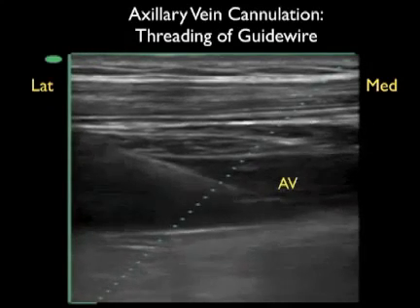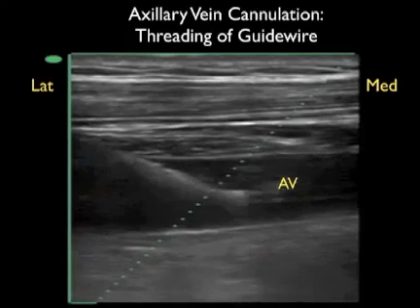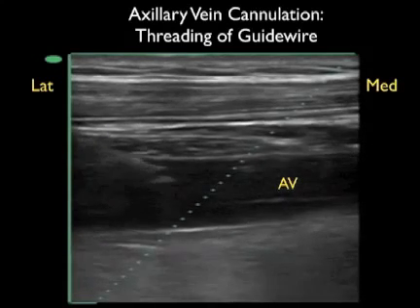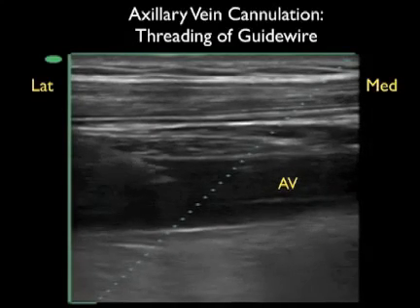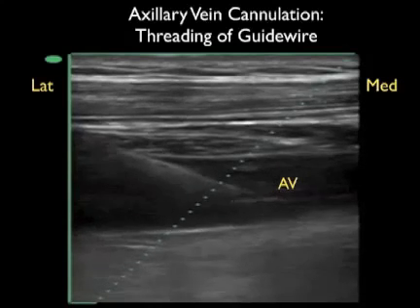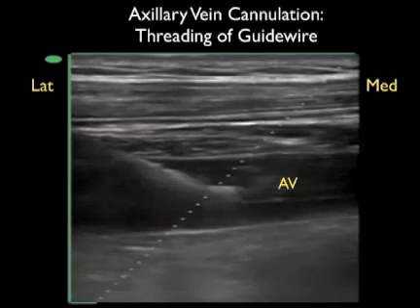Another use of ultrasound and the long axis technique, which I find very helpful, is to assess that the guide wire is safely within the position within the lumen of the axillary vein. Here we note the needle coming down from left to right, and we can see the guide wire passing through the tip of the needle, moving down the axillary vein, down towards the superior vena cava. This can be very helpful in assessing that the guide wire is indeed safely within the axillary vein prior to placement of the plastic catheter.